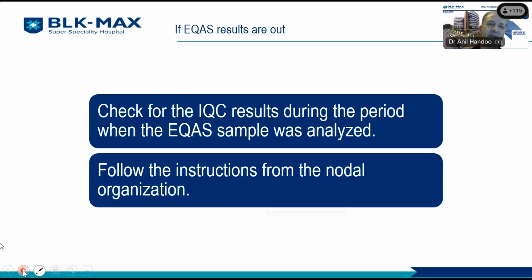So if the EQA results are out, what are we expected to do? We're expected to go back, check our IQC results for that period when the EQA sample was analyzed, and relook at whether we did the right thing when we were running the sample or not. Also, you must remember your EQA provider will actually tell you what they are running the sample on.